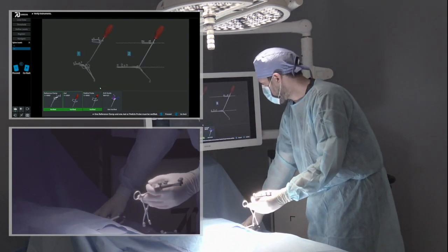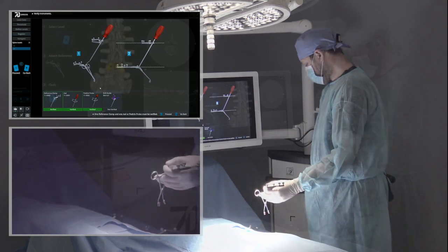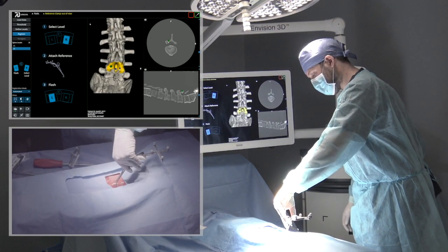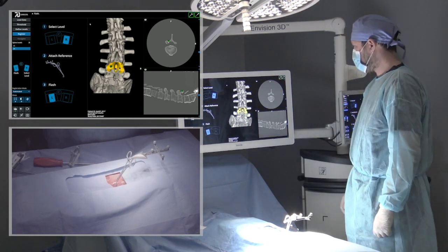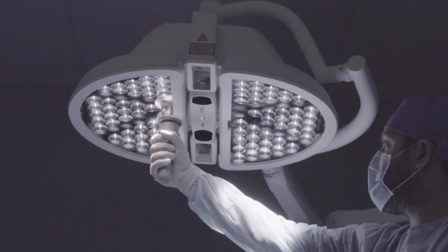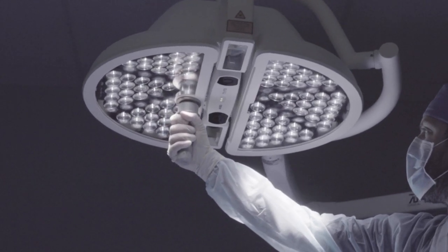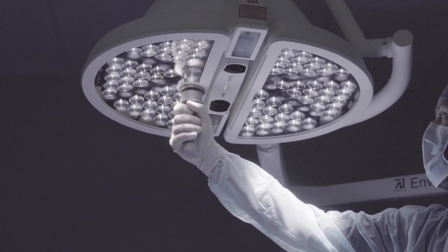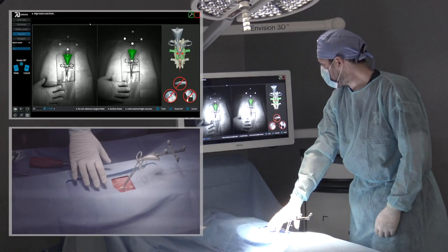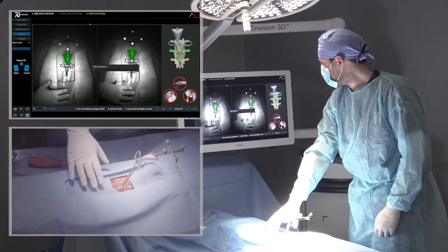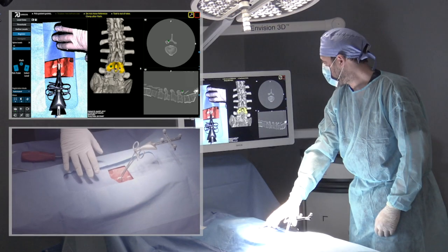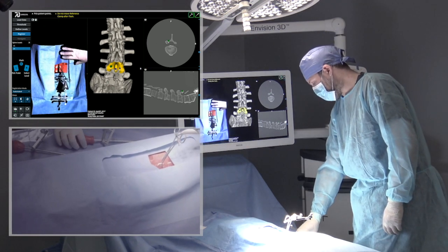Next, we will register the patient anatomy. We begin the process by placing our one-handed reference clamp on the spinous process of the level we intend to navigate. Next, the overhead cameras are turned on via the foot pedal and the surgeon aims the cameras into the incision using the aiming laser. Once the cameras can see the anatomy and the reference clamp as indicated by the green triangle, it is time to initiate flash registration with the foot pedal. With a flash of light, the entire surgical field is digitized with the cameras acquiring hundreds of thousands of individual points.